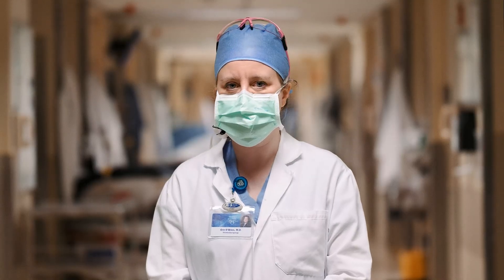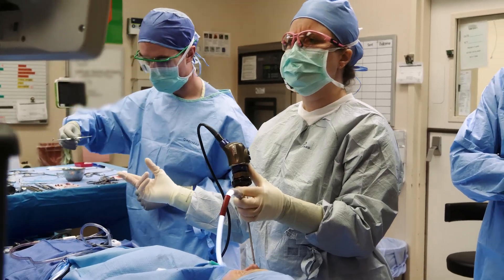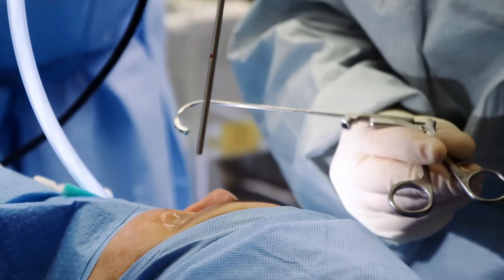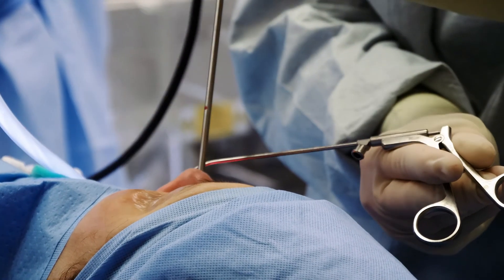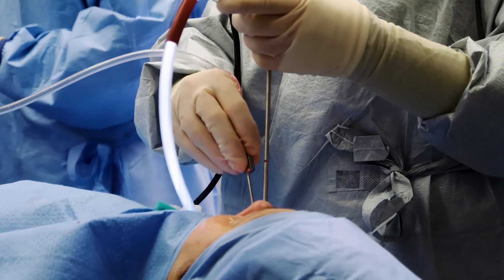The case is going to be done with an endoscope. We'll start with a zero degree endoscope. Some of the important steps: we're going to find the uncinate process, which is that sickle-shaped bone that covers the natural opening of the maxillary sinus. We're going to identify the natural ostium — it's important to find the natural drainage hole to that sinus first. Then open through that natural ostium and extend that opening posteriorly.